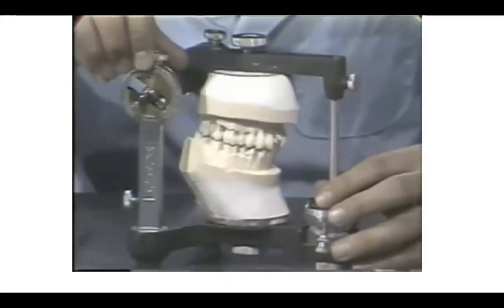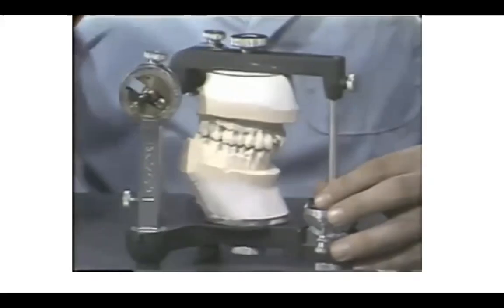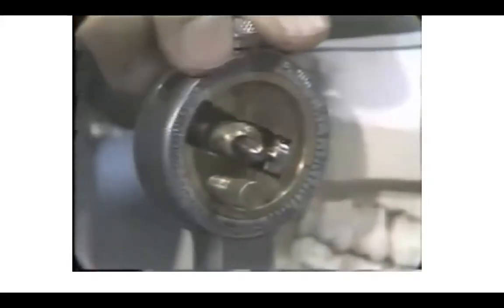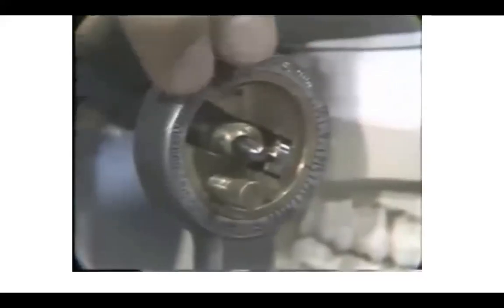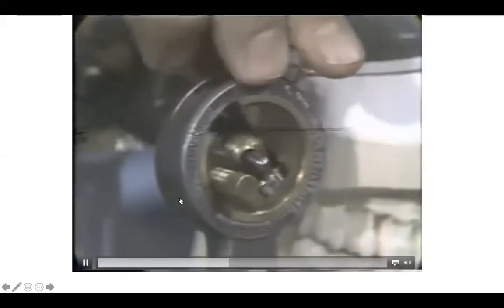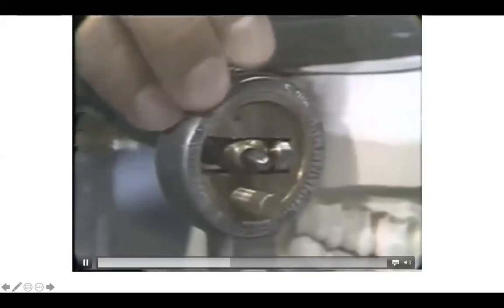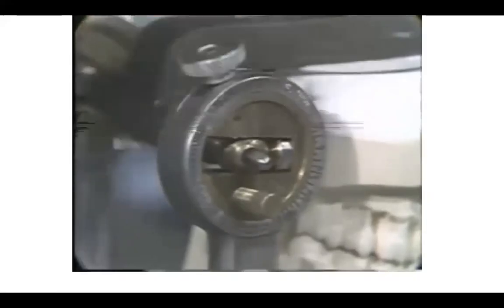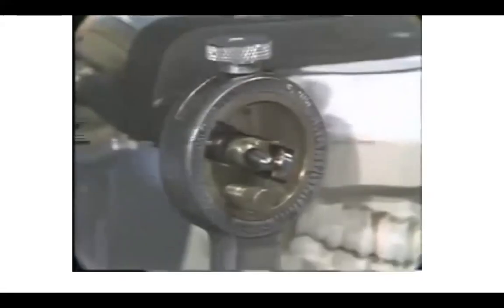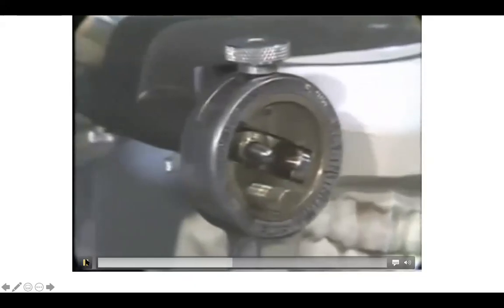Now we want to look at the track in which the ball is held. This is the horizontal condylar guidance, and it can be adjusted to what the patient's records may give you. If the patient has a steep condylar guidance, we set it such, and it could be very shallow or near zero. Now this becomes important in the second movement that the articulator is capable of making, and that is a protrusive movement.